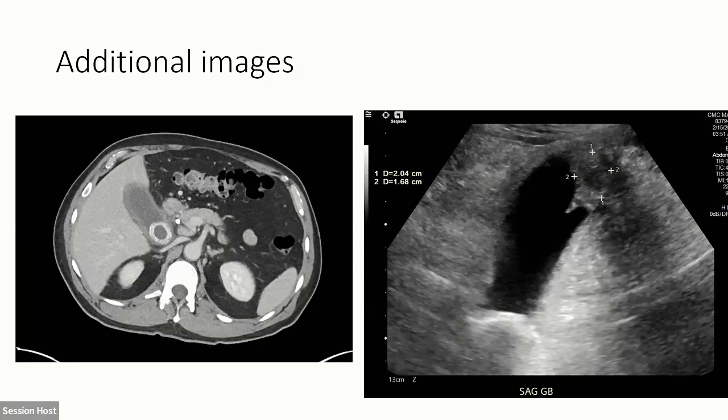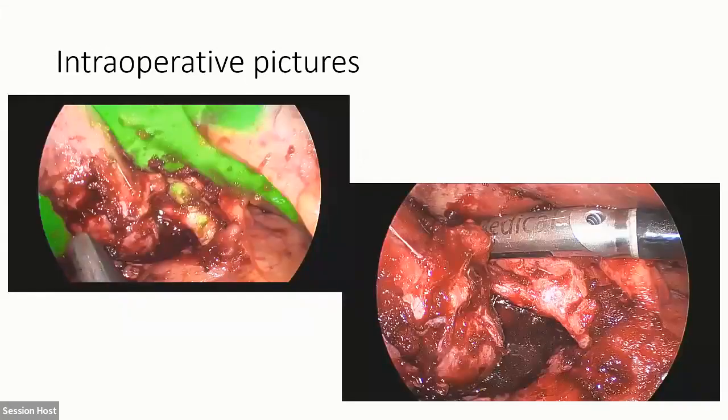And I said, well, I would rather do the case then. So I take the patient and get him set up and do all the appropriate counseling. And maybe we'll have to do lymph nodes and maybe we'll have to do a liver resection and whatnot. So we do all of this. I used ICG. This was great. I love the ICG for this patient. So it turned out beautifully.